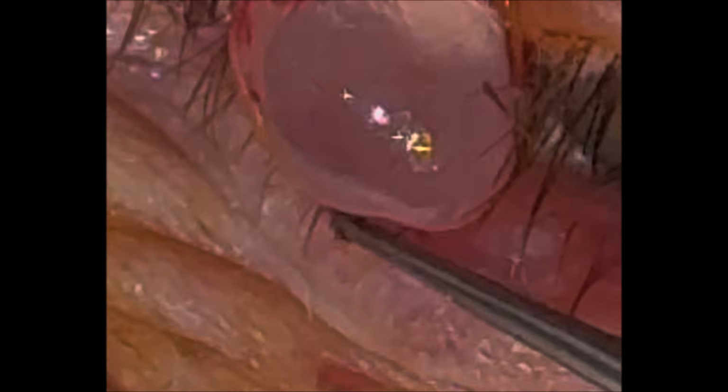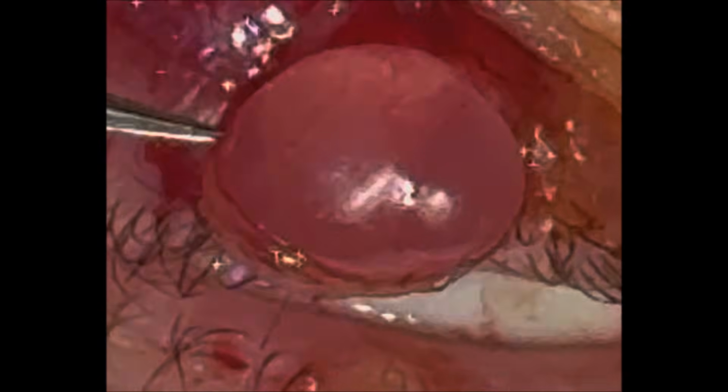I'm just using blunt and sharp dissection around the capsule, just trying to tease and peel off with blunt dissection with the forceps and with the scissors closed. With the scissors closed, I'm just using it as a peeling instrument, just like peeling an orange, just peeling the cyst off the eye.